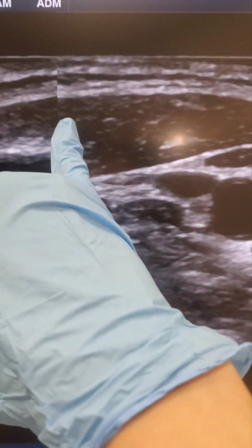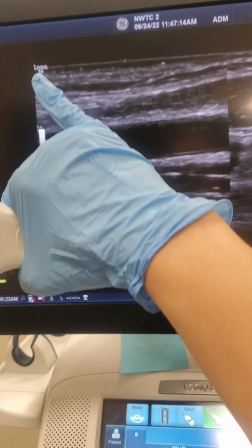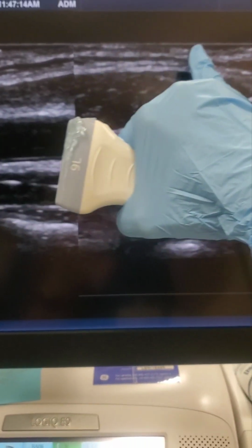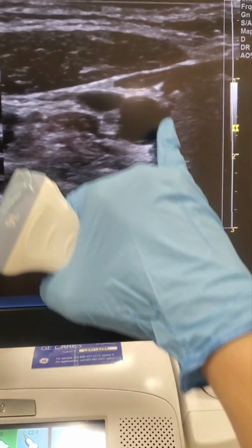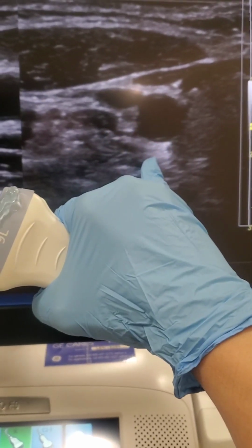Notch orientation is over here. Now I'm in a dual screen, so our indicator's up there on that side. But the notch side's here. So this is the patient's right, and then this is the patient's left. Here's that carotid, and then a short axis to it.